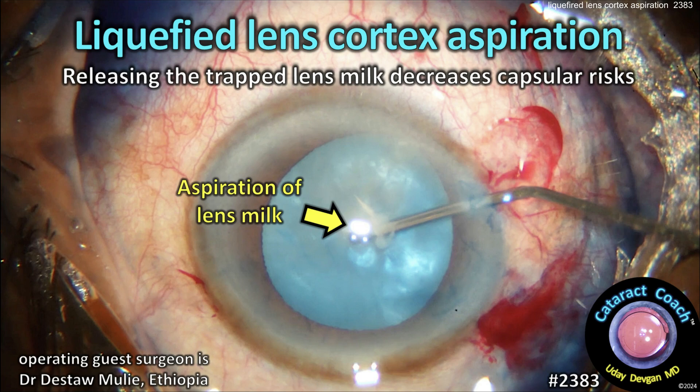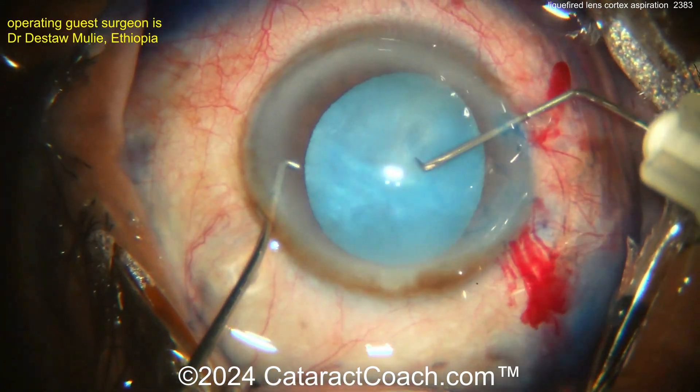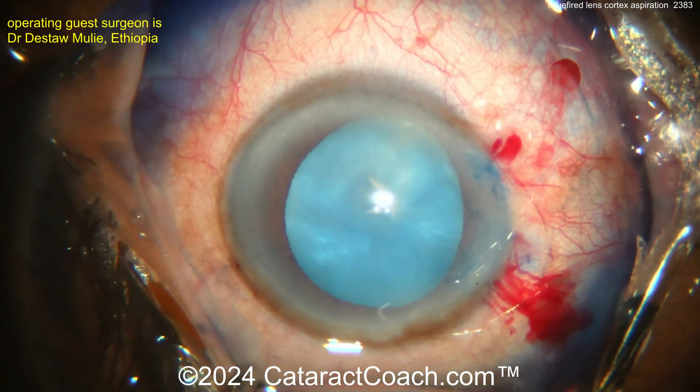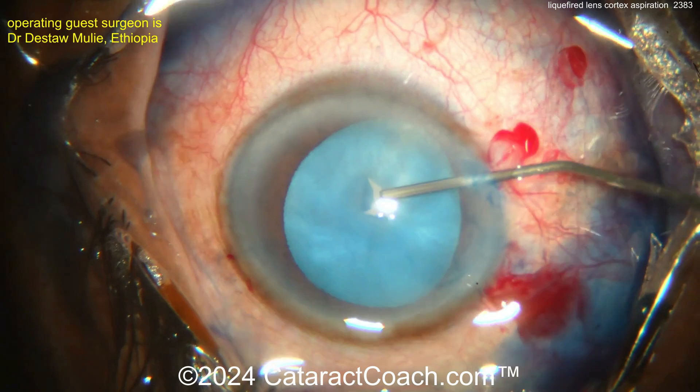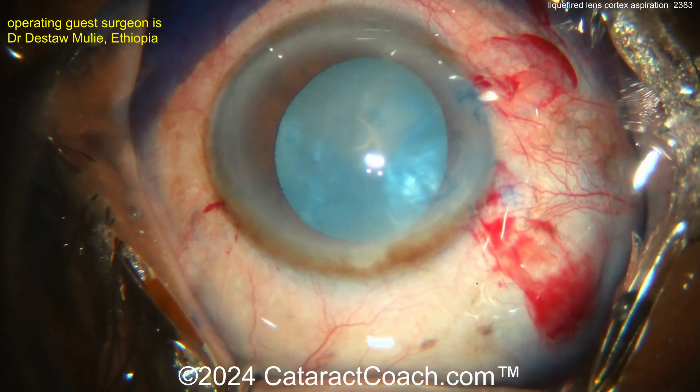cataractcoach.com — liquefied lens cortex aspiration. Releasing the trapped lens milk decreases capsular risks. We've shown you this technique before, so let's emphasize it here again. With a white cataract, you poke into the anterior lens capsule with a cystotome, and now going in with a cannula and aspirating — look at all that liquefied lens cortex.